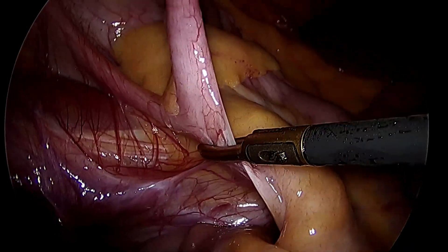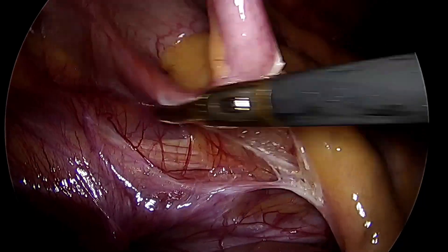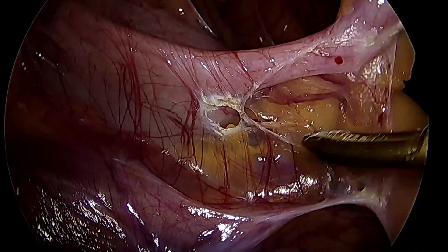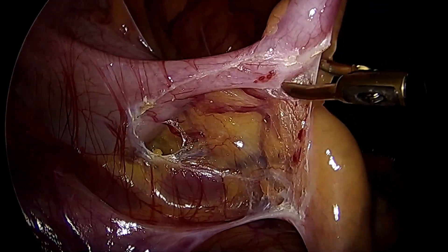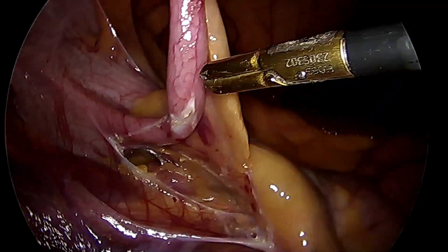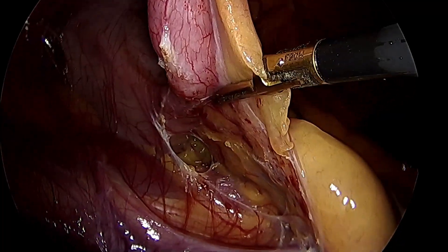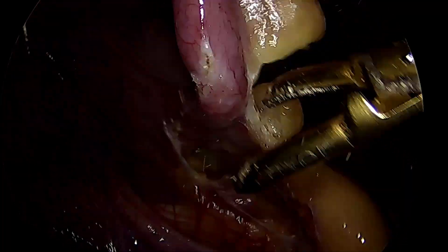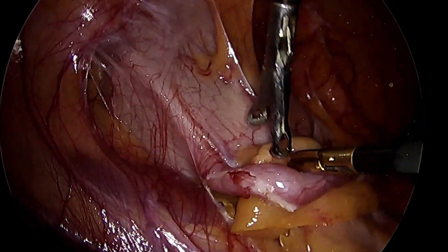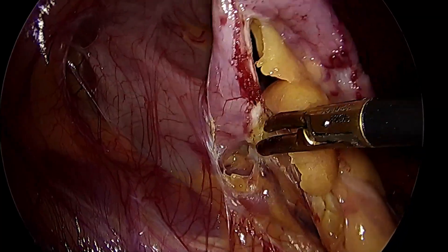These are the adhesions from past infection. Just releasing the adhesion — you can see the small vessels of the mesoappendix. Keeping my dissection close to the appendix body. I am not taking the mesoappendix completely in this case, as you see me doing in my other appendectomy videos, because I have to take out the gallbladder by stretching the umbilical port.